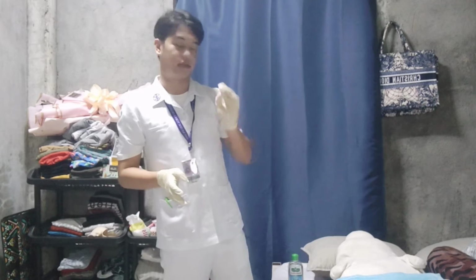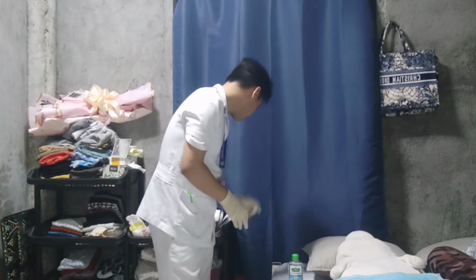So discard the cotton ball in the proper trash bin. So next is we need to prepare the syringe for injection. So we need to remove the needle cap while waiting for the antiseptic to dry. Then pull the cap straight off to avoid contaminating the needle by the outside edge of the cap. So this is to avoid needle prick injury.